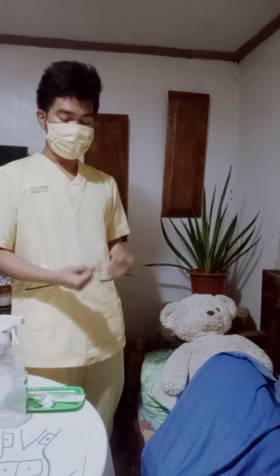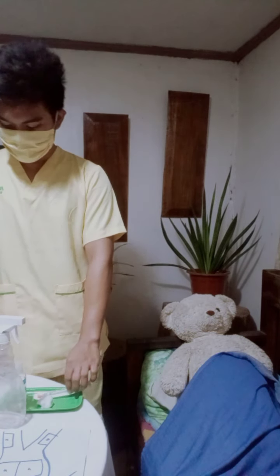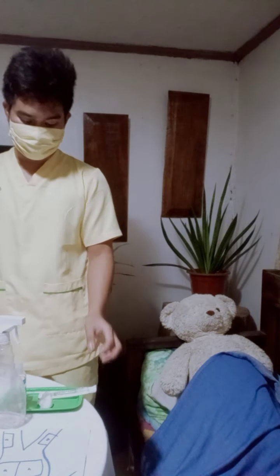The first thing we're going to do is identify our patient and explain the 10 rights of medication administration, of course. And then we're going to assemble the equipment needed in performing the procedure. Place it on the table accordingly to facilitate easy access to the equipment.